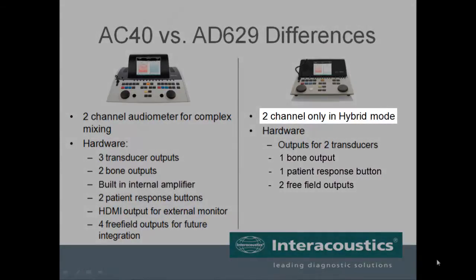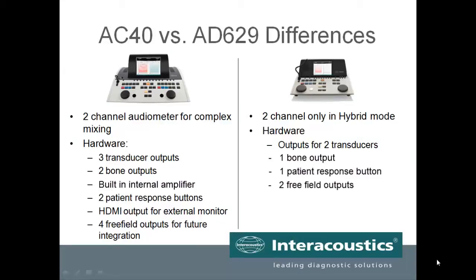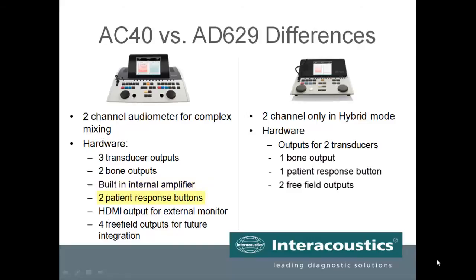The AD629 only has this functionality in the hybrid version when utilizing Diagnostic Suite. When looking at the hardware, the AC40 offers additional ports for increased functionality. These include three transducer outputs versus the AD629's two, two bone outputs versus one, a free field amplifier, two patient response buttons, HDMI output for an external monitor, and four free field outputs versus the two typically used, which will be accessible for future integration.